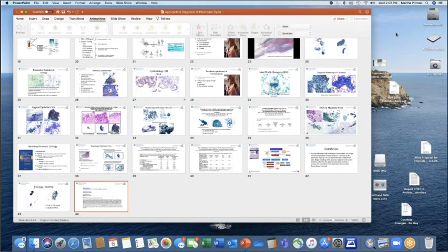So knowing where the needle traversed is important. Keeping in mind that whenever you put a scope down to the duodenum, you pass through the stomach, and there is a chance you can still get some gastric contamination in a transduodenal FNA. That said, if you know that the needle went through the duodenum, you're looking for duodenal epithelium, which generally comes out in large groups and is non-mucinous enterocytes. So the enterocytes don't have mucin in the cytoplasm unless there's peptic injury. So keep that in mind.